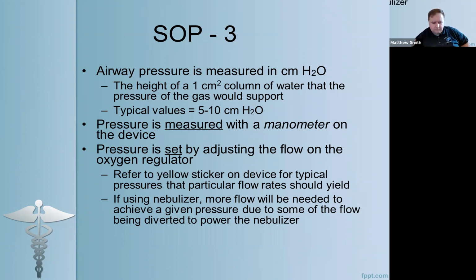And one of the neat things that you can do is engage in titration, right? The idea of titration is you can start with a lower value, see how that goes, then you can increase it, see if the patient does better, see if they do worse. If they do better, you can increase it some more. If they do worse, you can go back to what you had. So you can adjust in real time and see how the patient does.